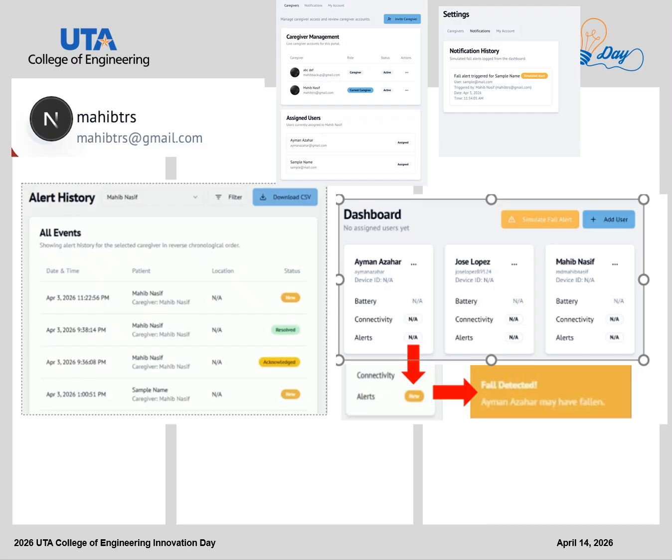which is the way we ended up setting. We set up integration from our device to the mobile applications, and from there, the mobile applications transmits information to the web services using AWS, of course. And this is an example of our web applications.